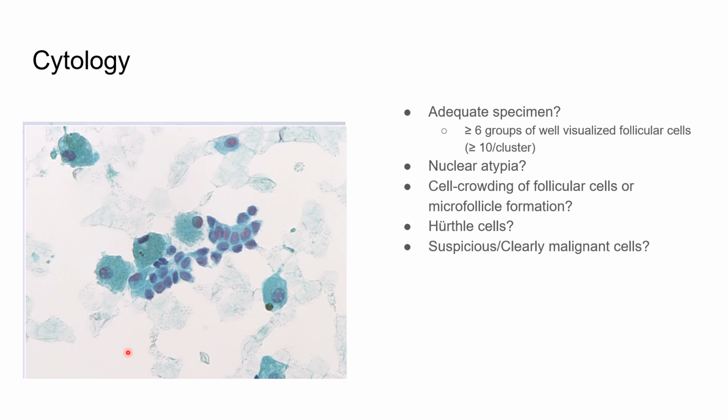The other question is, does it have nuclear atypia? This isn't just where it's frankly horrendous, cancerous nuclei, but if you look at these, they don't quite look right. There's something wrong about them, and it does bring up a level of concern.